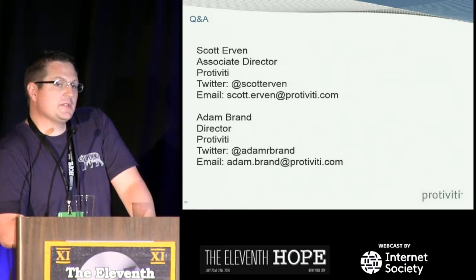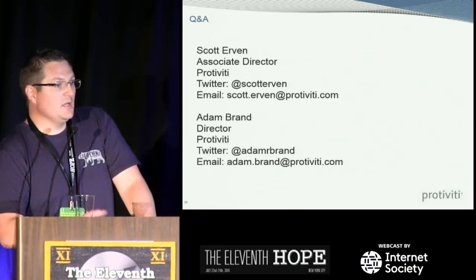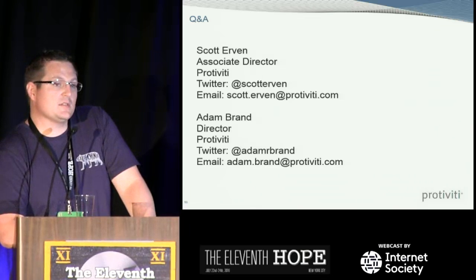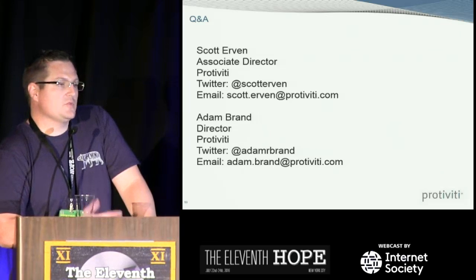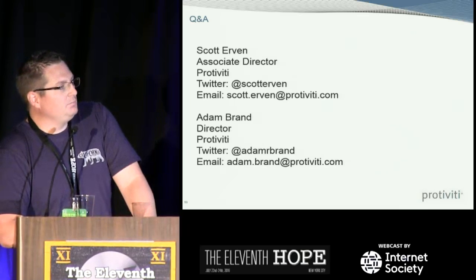Absolutely, yeah. We've definitely taken a look at those types of systems all the way from implantable defibrillators to pacemakers. I think some good research has been done before, all the way back in 2008. Dr. Kevin Fu, who's now at University of Michigan and leads Archimedes, did some really good research back when we weren't using any type of encryption. They would call it proprietary, but it was really just radio frequency over the 400 band and lack of encryption, and you could do near field communication for software updates. Yeah, absolutely.